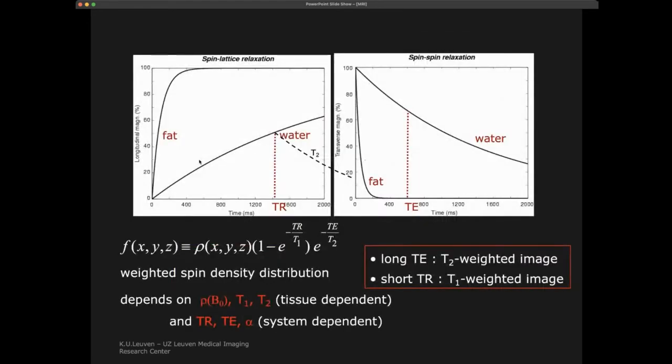Well, of course, it's the relaxation. Depending on when I measure, so the measurement itself has to be short so that during the measurement there is no relaxation. But when we do the measurement, that, of course, will determine at which phase in the relaxation process we are. So the echo time is what we call the time when we measure. We start the sequence always with flipping, and then we measure after a certain amount of time, and that's what we call the echo time.